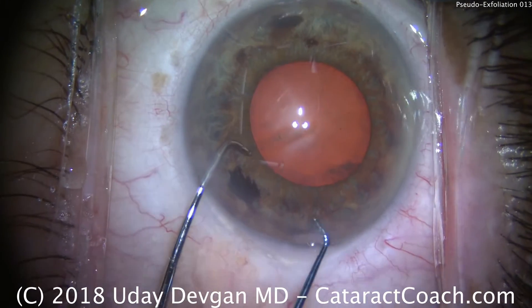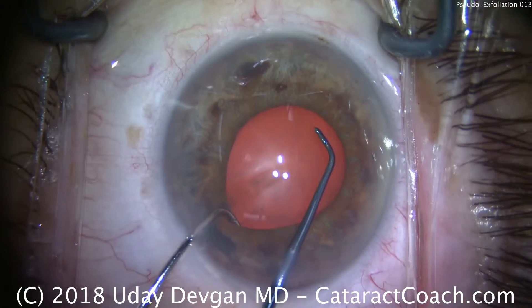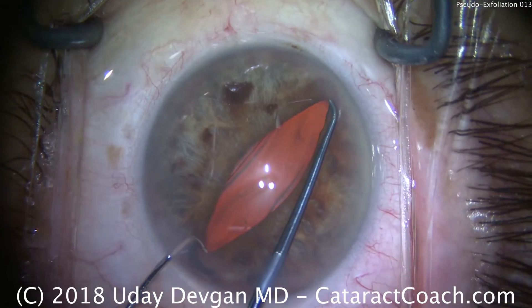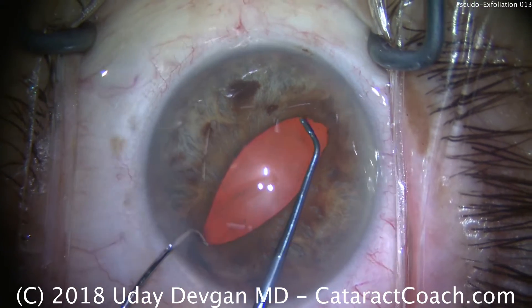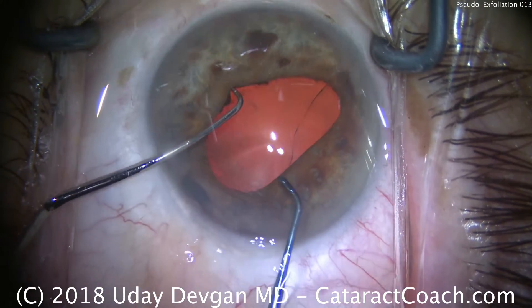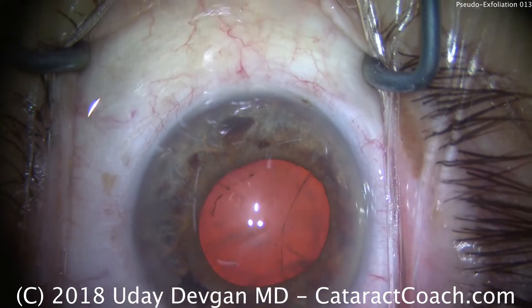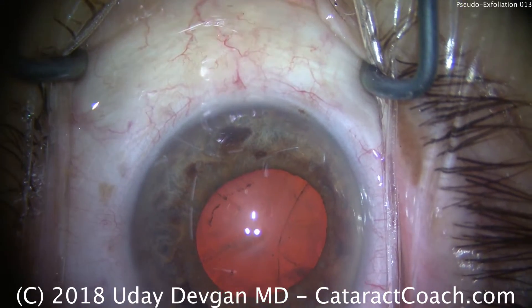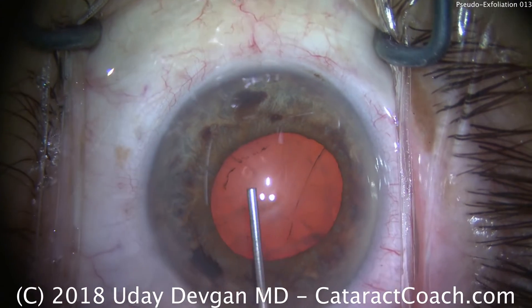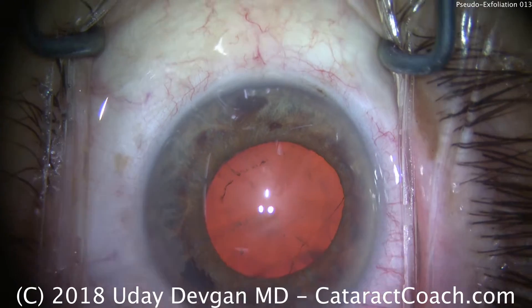Now we're going to use two choppers, one on each hand, and with the choppers we're going to gently stretch the pupil. We can go in one meridian, we can go in multiple. Here we're going to stretch one direction and now the other. Be careful when you do this — don't touch the anterior lens capsule, because you don't want to puncture it. Now a little bit more viscomydriasis, and now we have a pretty reasonable pupil.